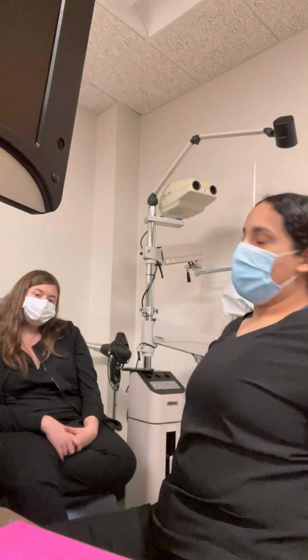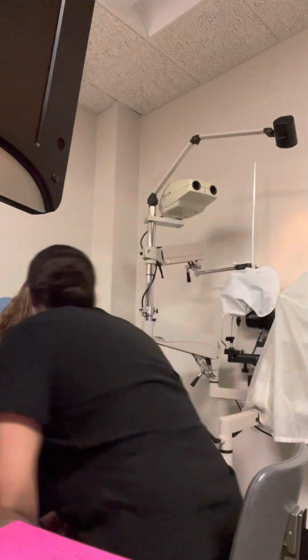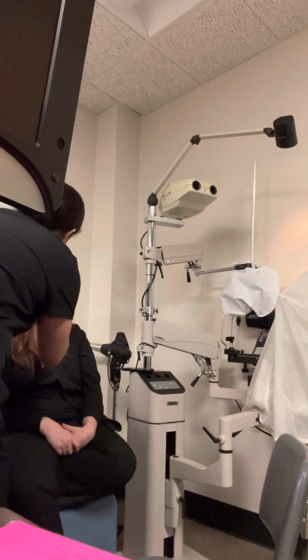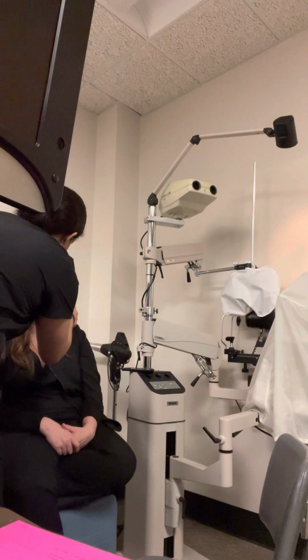Next, I'm going to be checking how quickly your pupils respond to my light. Okay, so go ahead and stare at that screen for me. I'm just going to flash the light in your eyes a few times, okay? Now we're going to be testing how your pupils respond. So we're looking at a distance target to a near target.